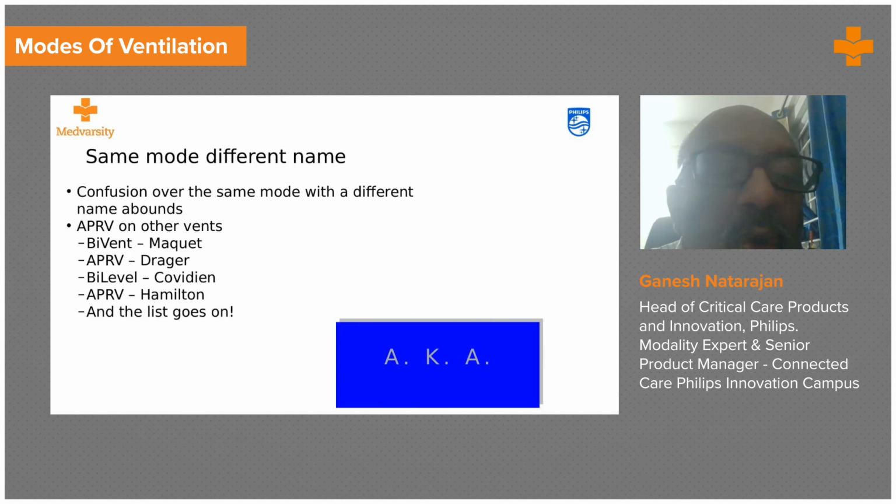I pause here. This is the basics of mechanical ventilation. We looked at the modes, we looked at the breath types, we looked at the volume control, we looked at the pressure control, and all the modes that can be driven by either volume or by pressure.